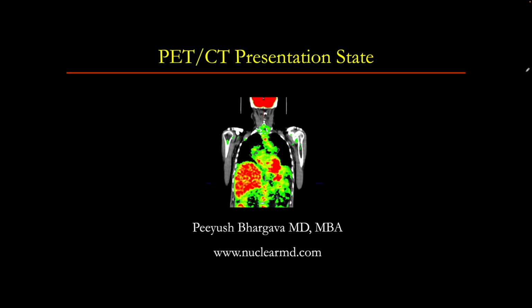Hi, this is Dr. Bhargava, and this short video is about PET-CT presentation state. How do you present your PET and CT images? Is there a right way to do it? Is there a way that you can convey the most information to your audience? This is my take on it.